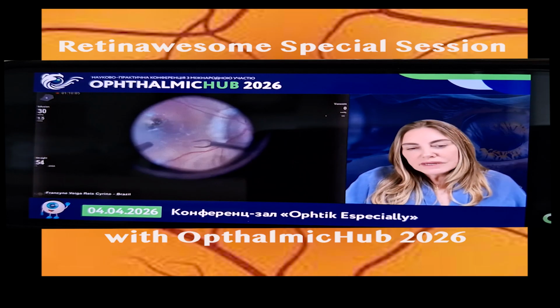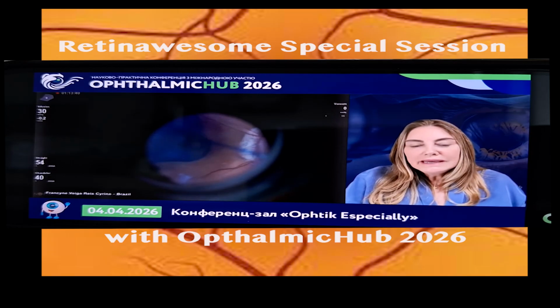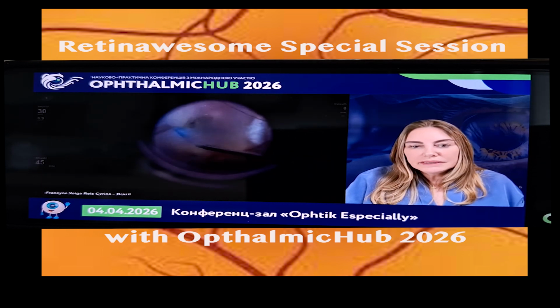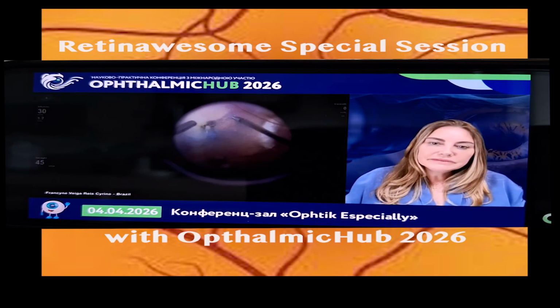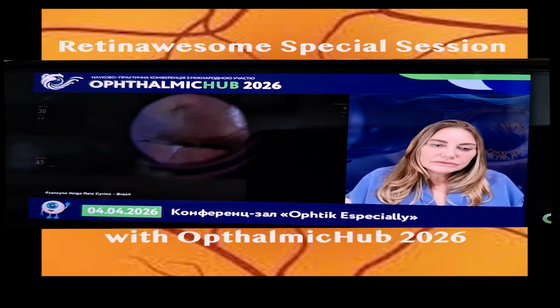And then we perform the vitrectomy. We dye with Brilliant Blue, remove the posterior hyaloid, and those eyes with high myopia have multiple layers of epiretinal membranes, hyaloid skin, I don't know how we can name it, but you have to be sure that you have peeled all of them.